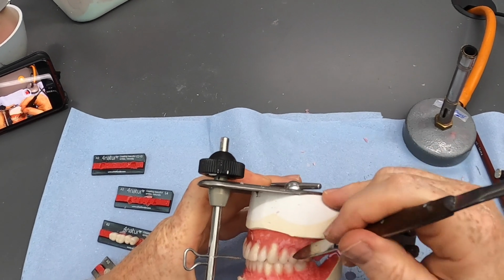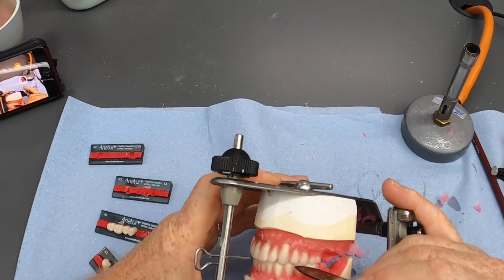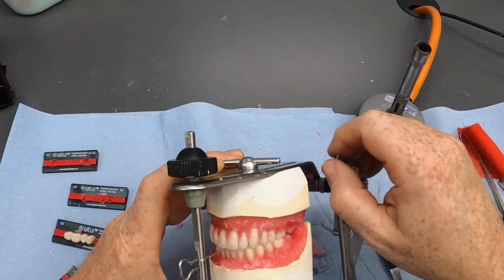There, we're not far off at that. Straighten it up. Buccal cusp up a touch. Good stuff. Okay, let's have a quick look at the lateral excursions then.